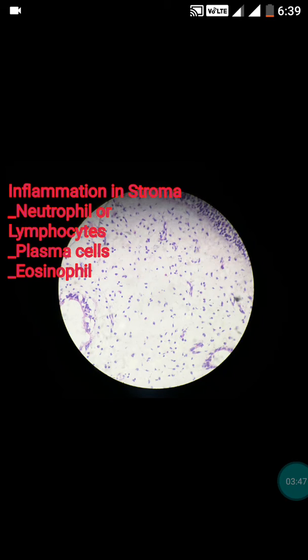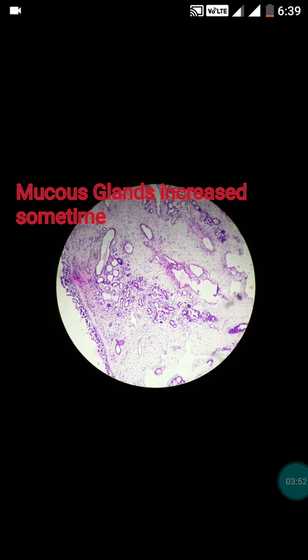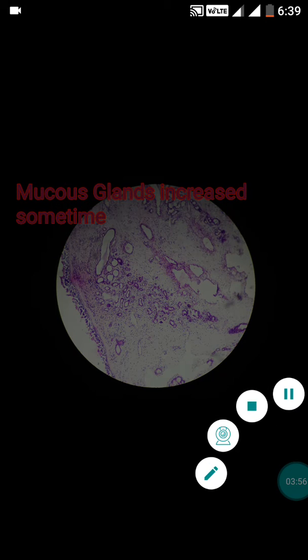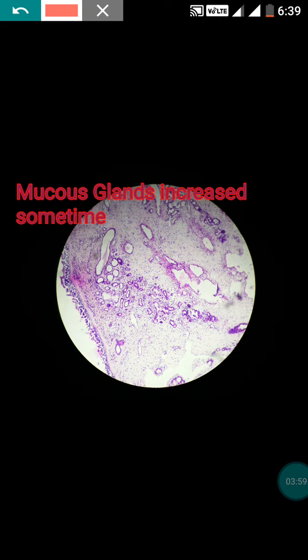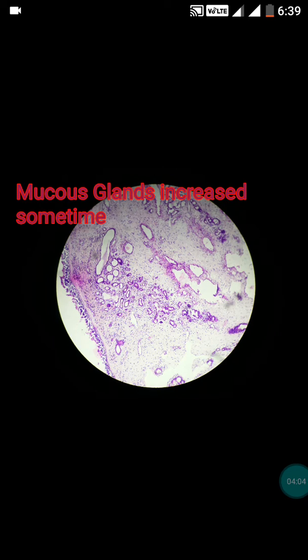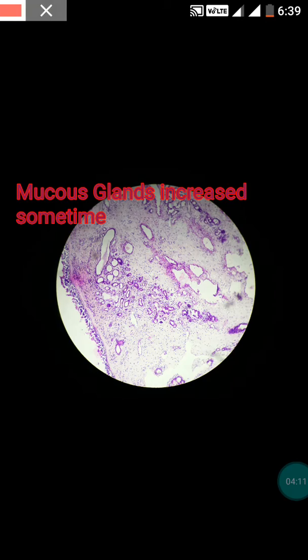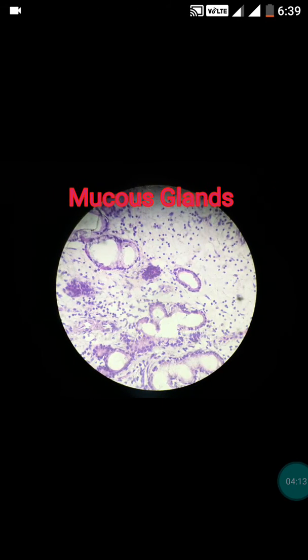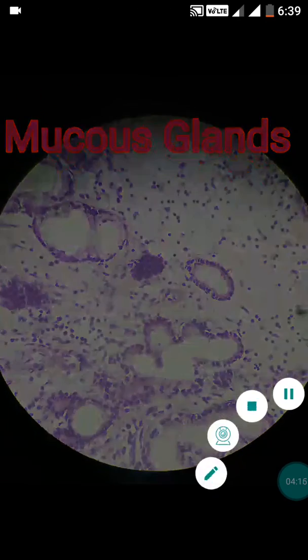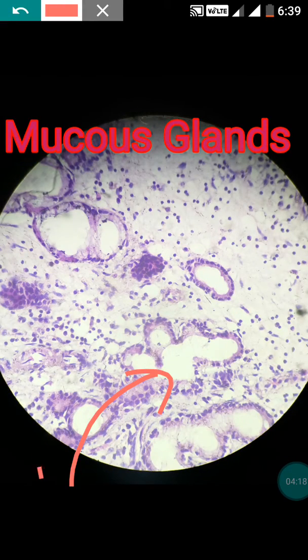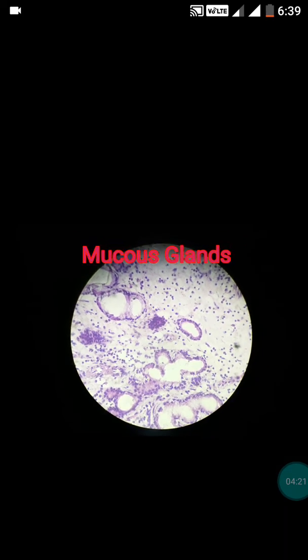Sometimes eosinophils can be present in high numbers, and such a polyp is called an allergic polyp. The third characteristic feature of the polyp is an increased number of mucus glands — there can be hyperplasia of the mucus glands. In the high power view you can see the mucus glands with hypertrophy.